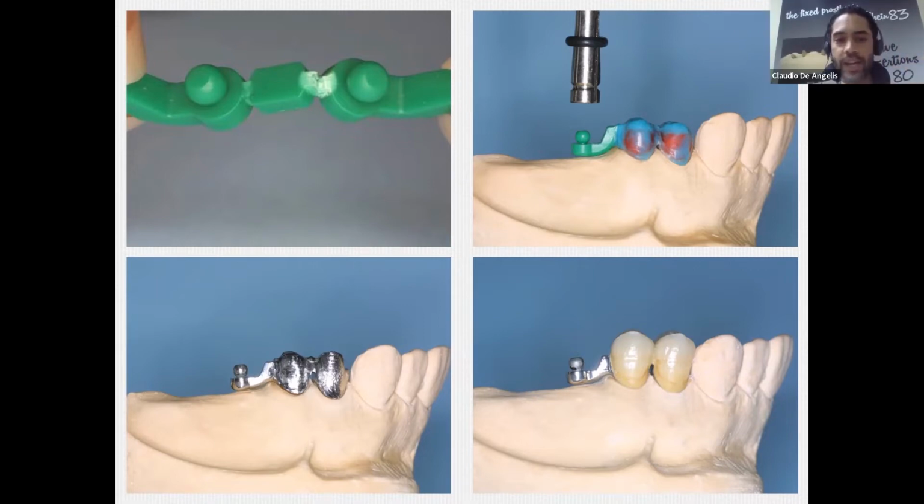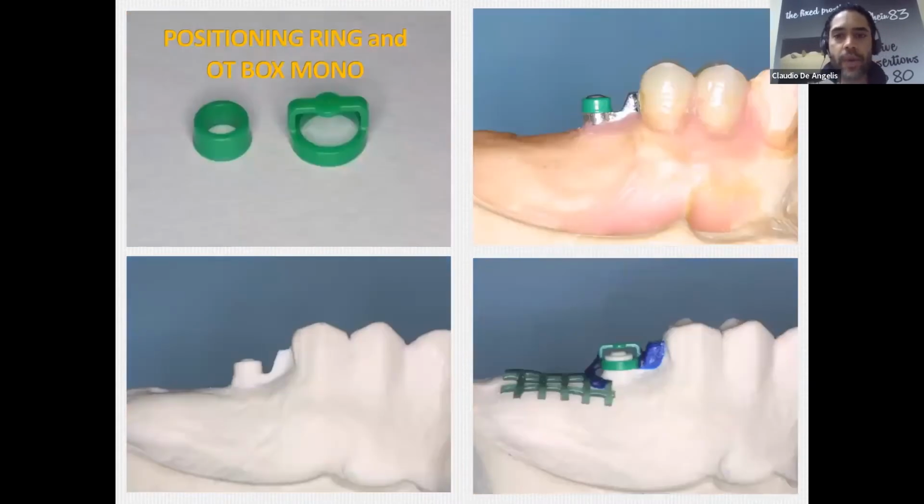And after the casting, the technician just covers the crowns with aesthetic ceramic, composite, whatever. Note that also here I need to respect this flat surface. Why? Because we need not to create a lever which will destroy our teeth covered by the crowns. Let's see how to duplicate and how to produce the metal frame.